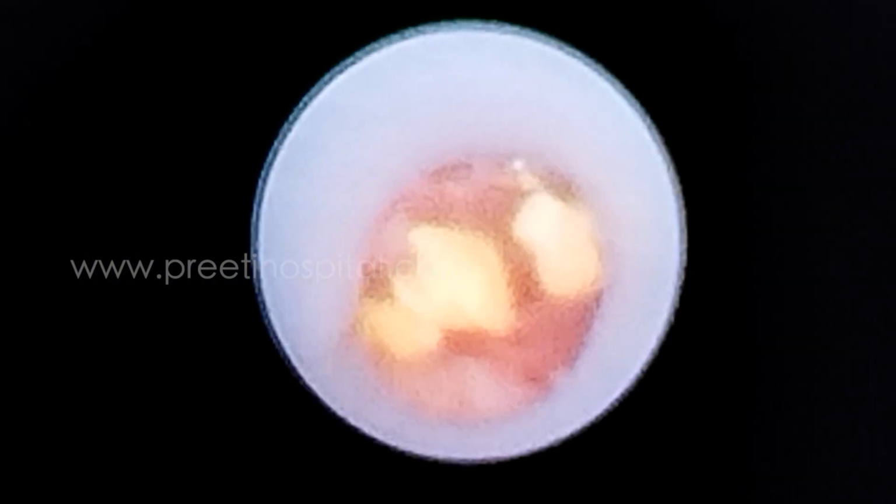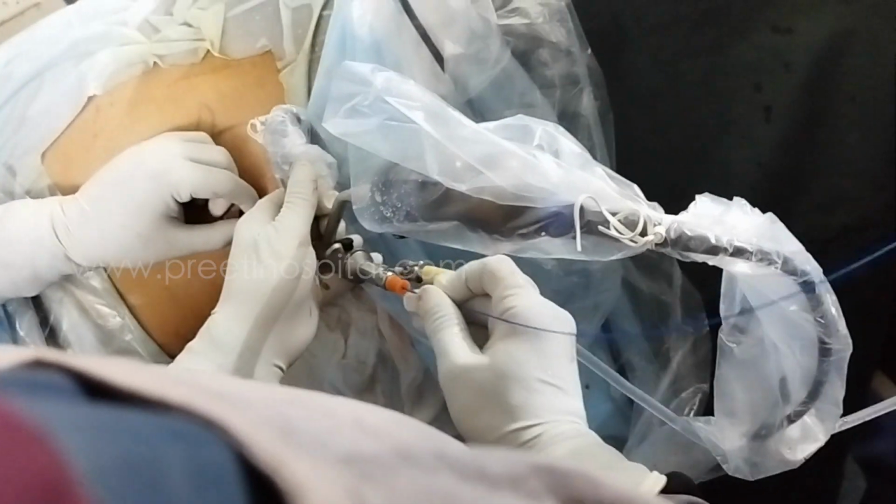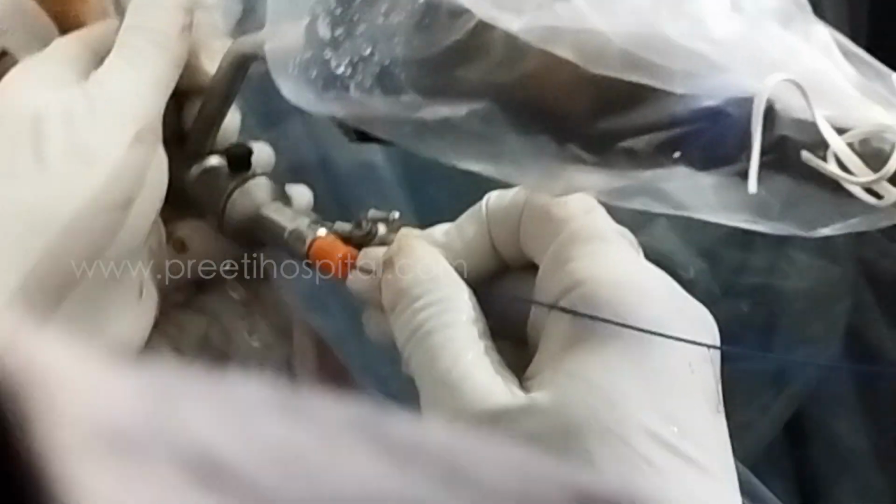Nobody likes that. So now I am moving the Amplatz sheath inside, so that all the fragments will directly open into the mouth. Now here laser usage is little. Your flushing is not transmitted because of the impaction. Otherwise, all the fragments might have come. These are the fine points you have to learn. This impaction is good or bad? It is good because small fragments will not go into the calyx. Sometimes laser can hit the opposite wall here.